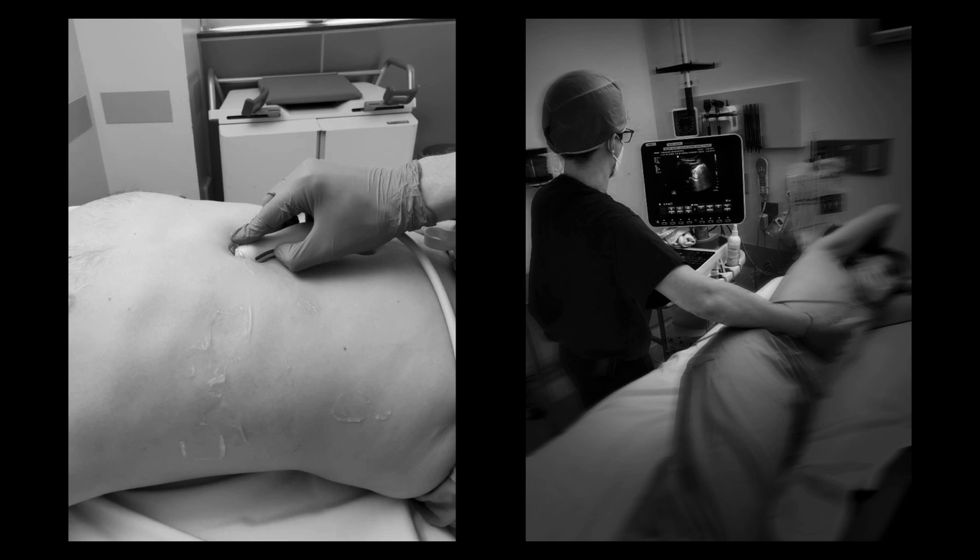So sometimes it's not as feasible as others, but if the patient's awake and alert and talking and just sitting in the bed, oftentimes having them roll onto their left shoulder, right? And not just a semi-roll, but a legit roll onto your left shoulder will help open up that space, make that window a lot bigger, so you'll be able to see a lot better, and you'll be surprised at how much that's going to help you as you're scanning your patients, right?